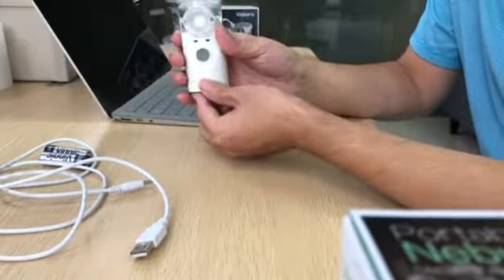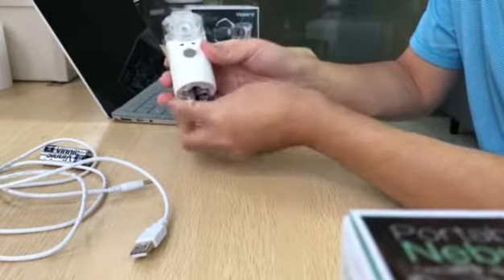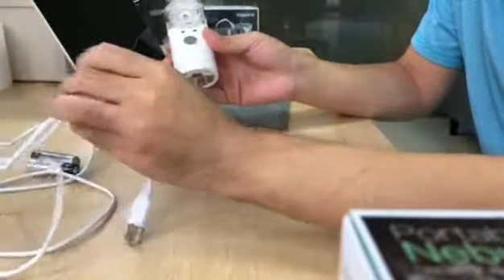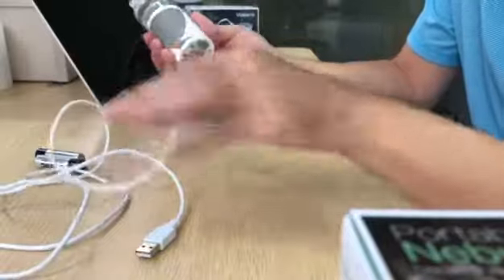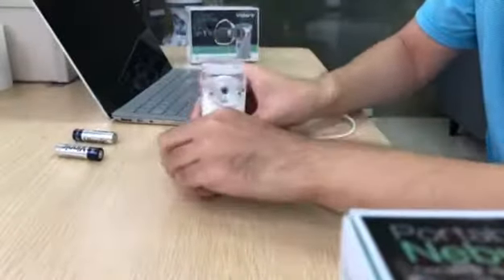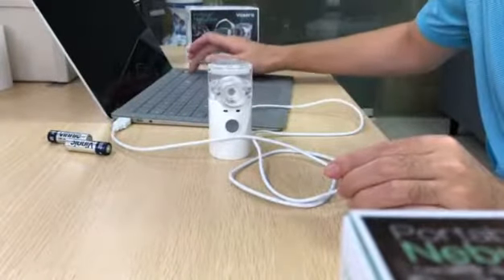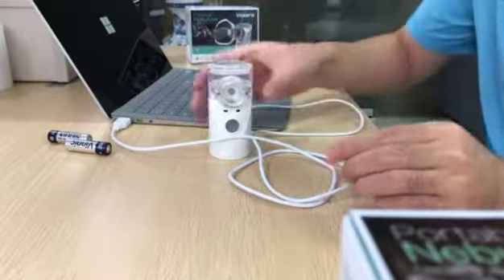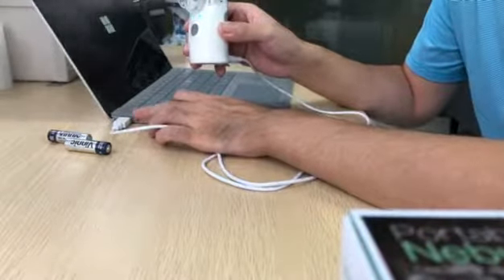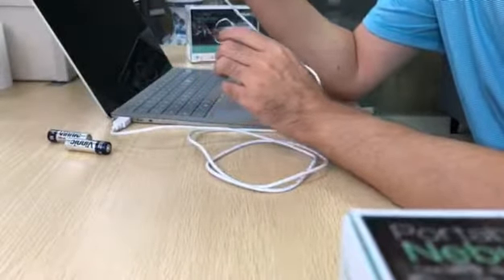By the way, if the battery cannot work for you, you can also confirm whether the USB works. Take out the battery. Use the USB cable to connect with your laptop, or a 5 volt adapter is also okay. Now it works.